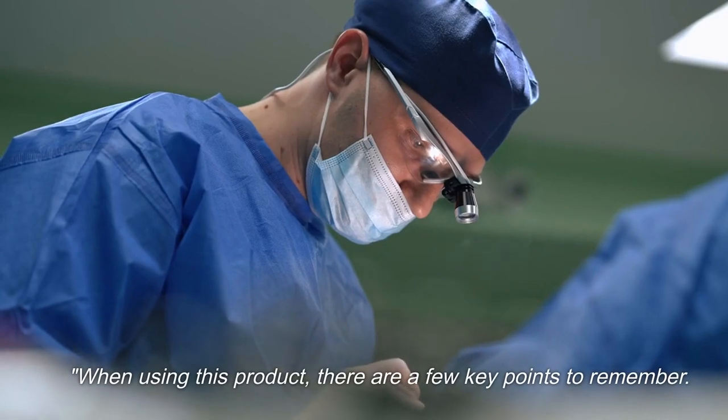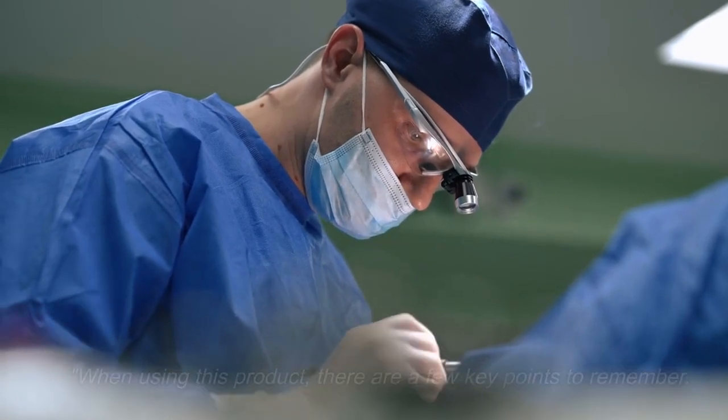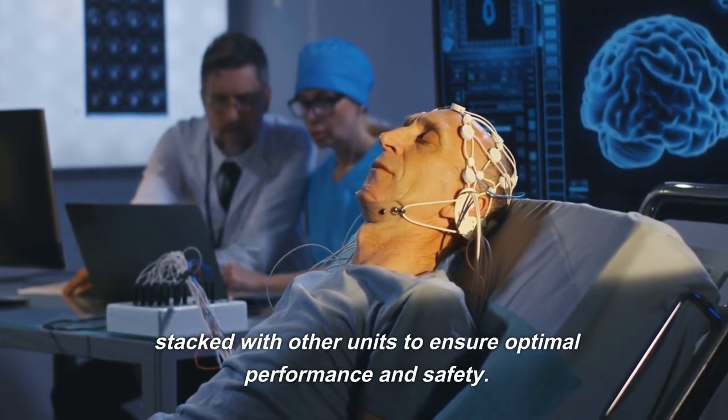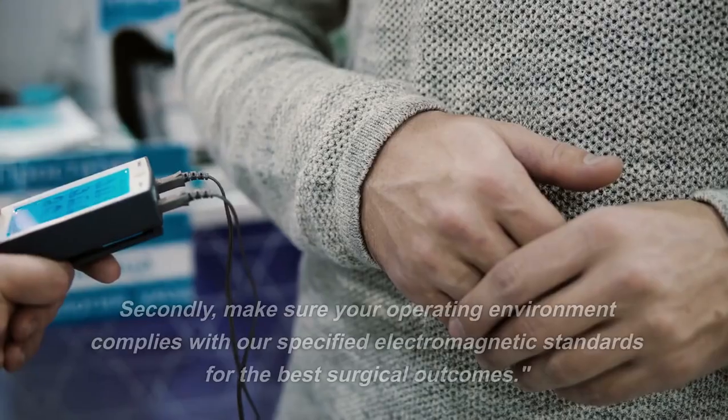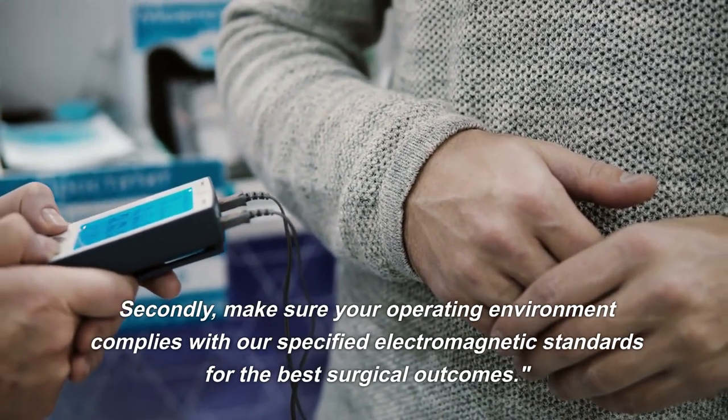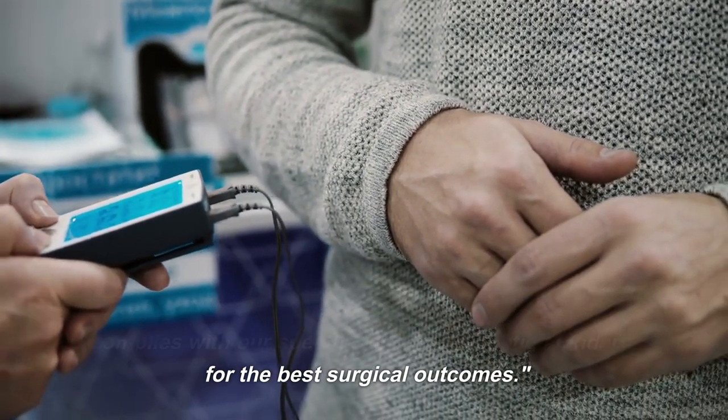When using this product, there are a few key points to remember. Firstly, avoid using the electrode adjacent to or stacked with other units to ensure optimal performance and safety. Secondly, make sure your operating environment complies with our specified electromagnetic standards for the best surgical outcomes.